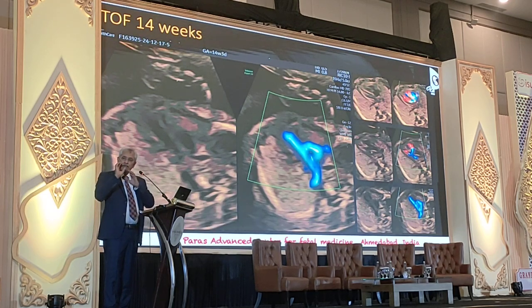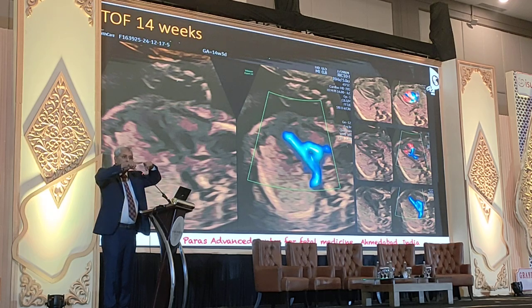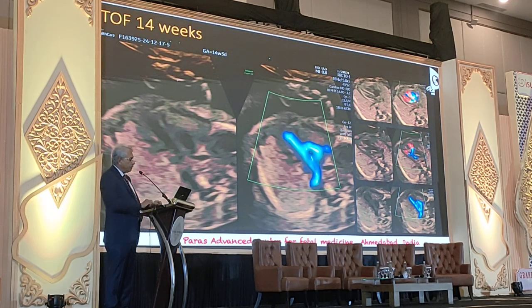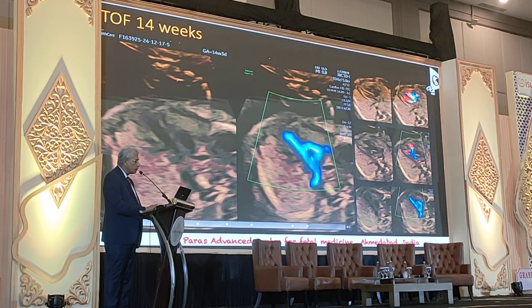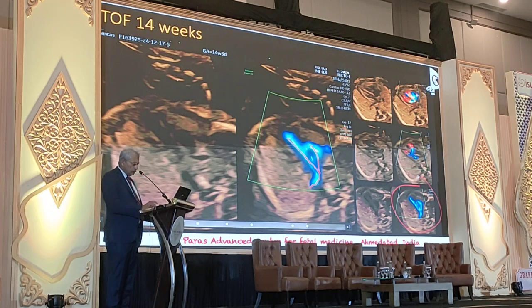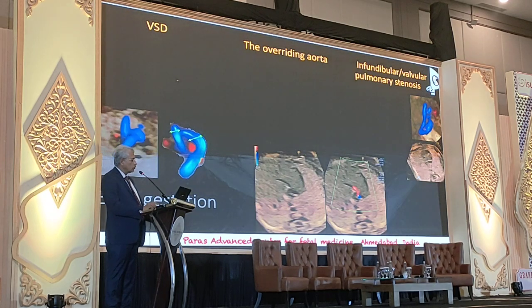Usually the pulmonary artery and aorta will form a V. Here it is forming a Y. It will end up in the middle of the arch, and that is what is required. It is here, and then this is a complete arch. So it is joining in the middle, and this is what you can see, that formation of a Y is a classical early sign of tetralogy of Fallot, and that's what you should be able to identify.